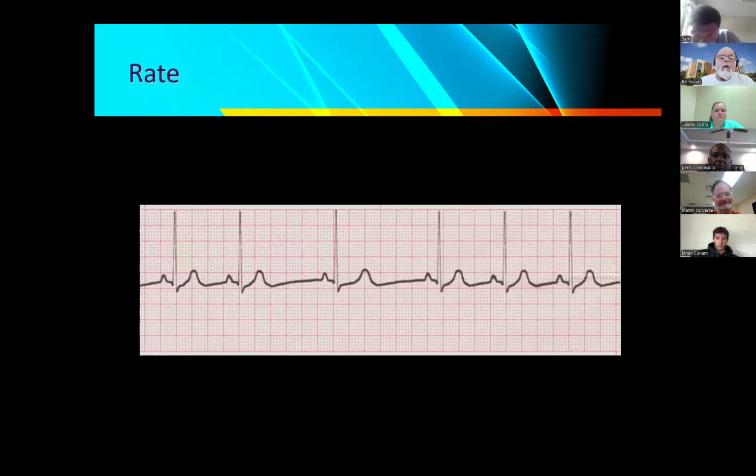Okay. Now, rate. Is this a 6-second? These are all 6 seconds. Yes, okay, ma'am. So 60 BPM. Good.